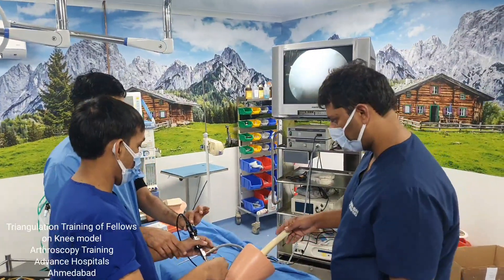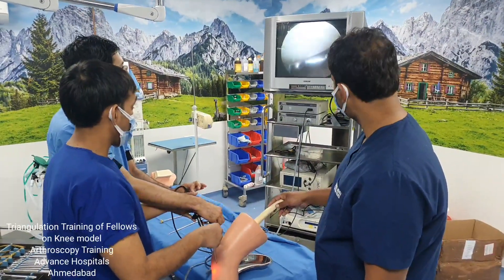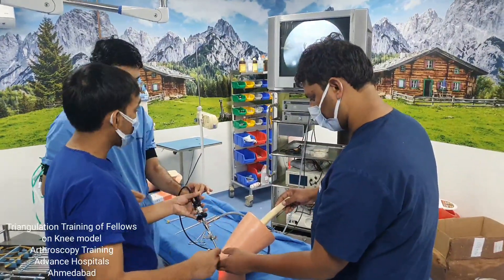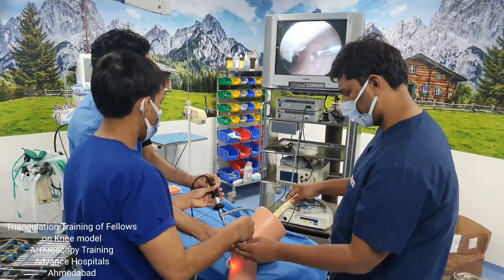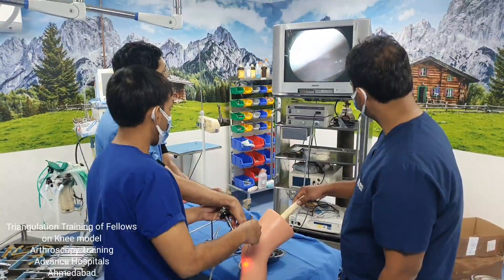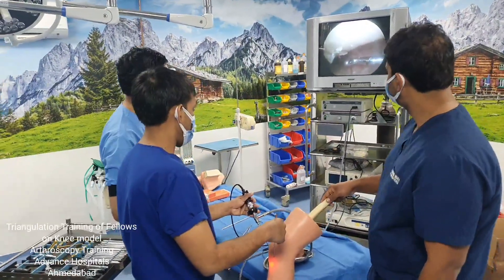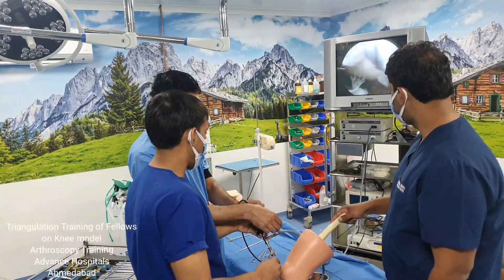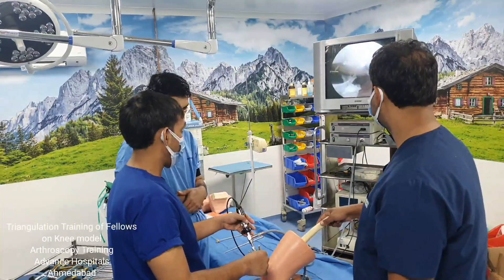The important thing about handling the scope is you should hold the scope steady, and if you want to mobilize, you can just move the light source. Keep the probe in picture and then move your light source this way or that way to change the view you are getting. For major adjustment, move the scope; for minor adjustment, move your light source while keeping it in position.